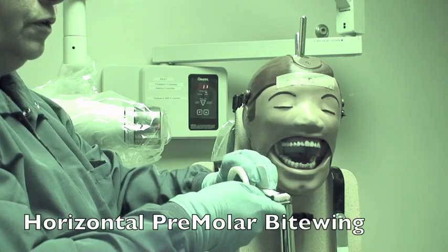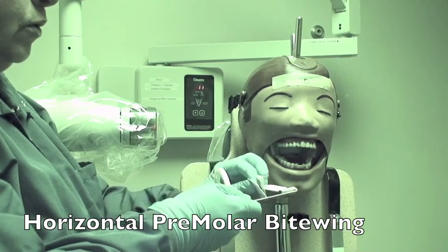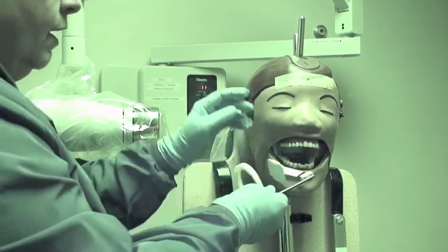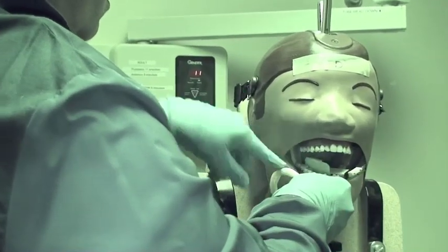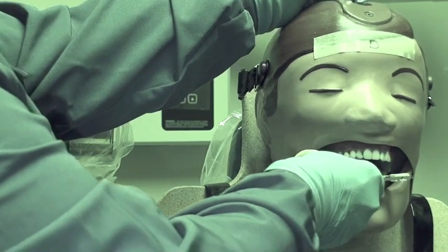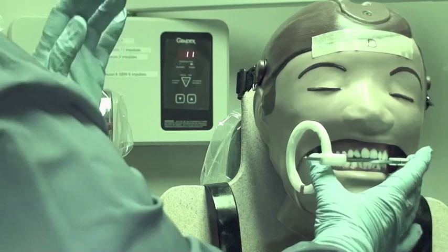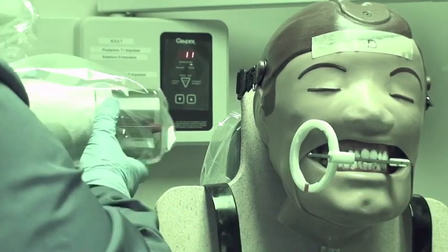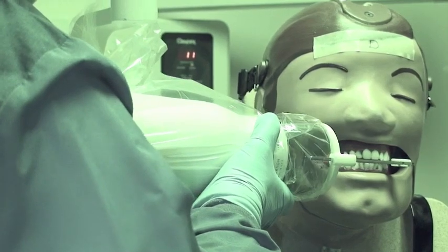When using the premolar view with the RIN holder, turn the holder towards you, place the white side of the film towards you, and then go across the arch — between the lateral and canine on the opposite side. As they close, bring the ring back to be centered over the premolar. The ring has to be centered between both arches, then make your PID parallel to the ring.